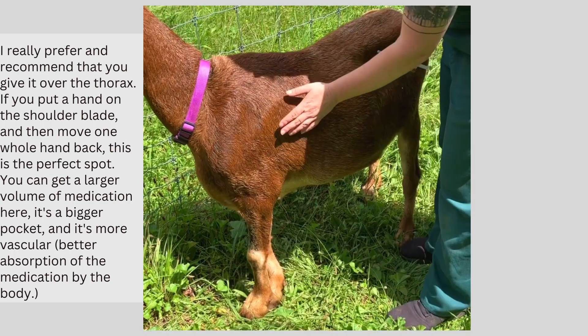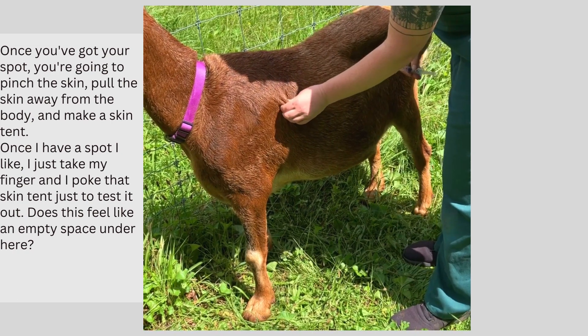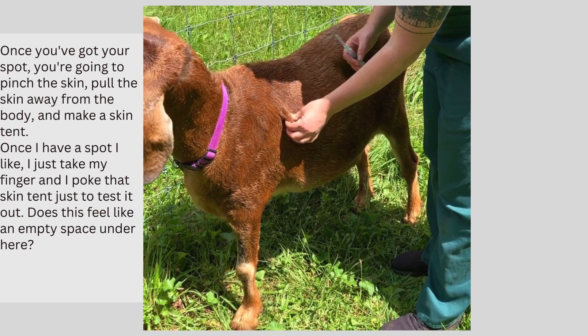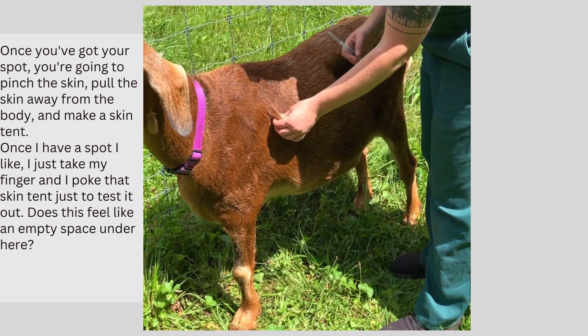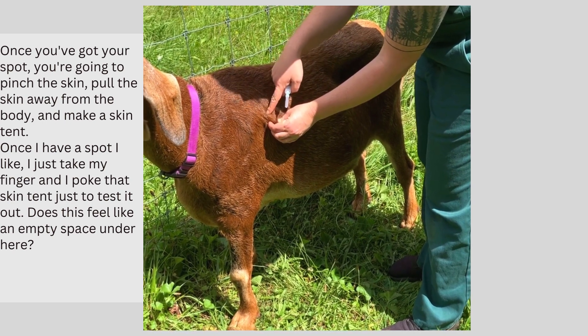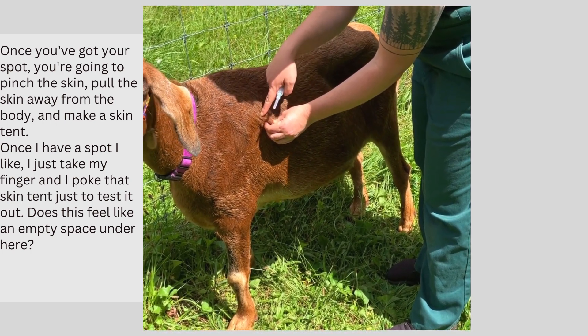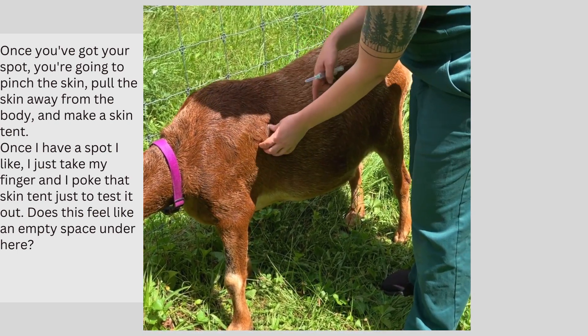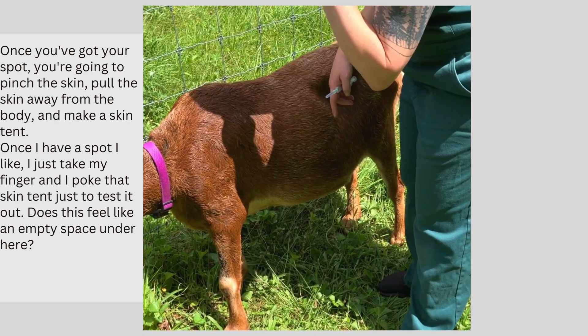Once you've got your spot figured out, you're going to pinch the skin, pull the skin away from the body, and make a skin tent. Once I have my spot and I like it, I take my finger and I kind of poke that skin tent just to test it out and see — does this feel like an empty space under here? Am I going to run into a muscle? And once I like that spot, I'll go ahead and give the injection.